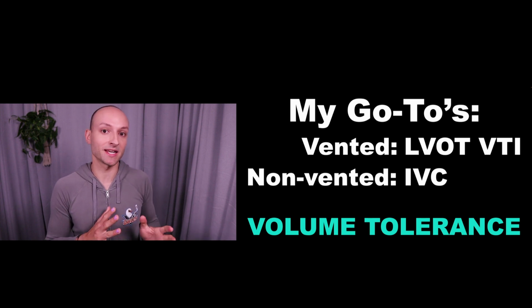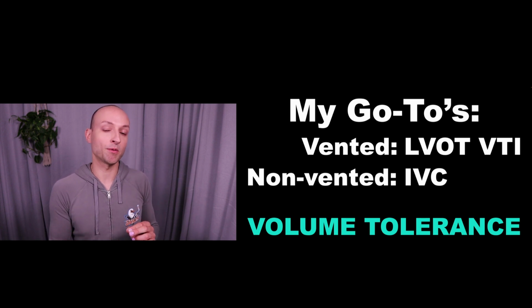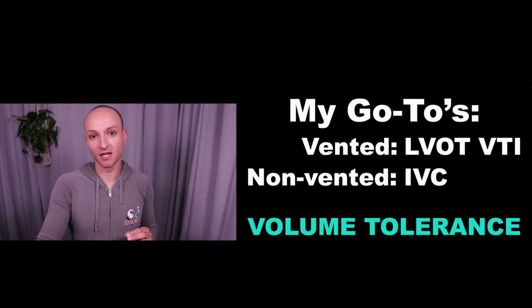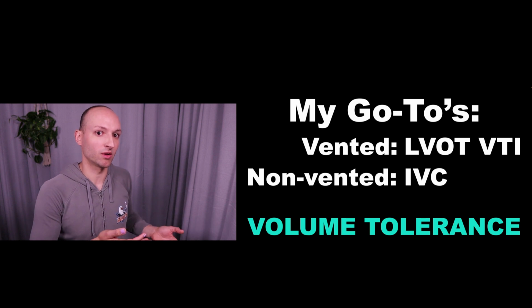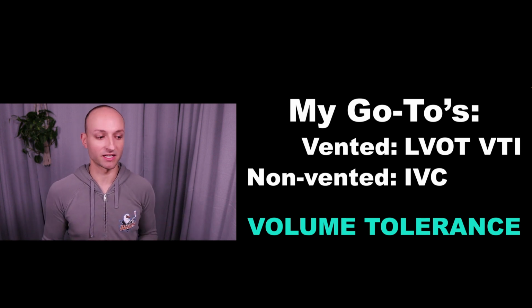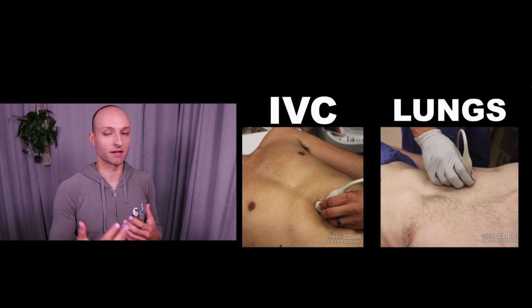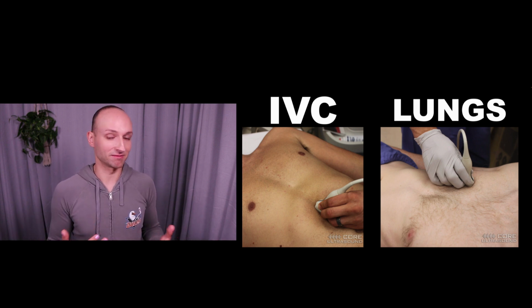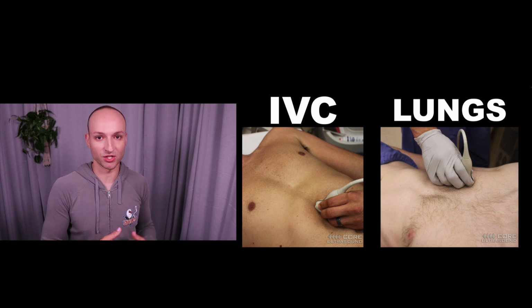It's volume tolerance. Instead of thinking, will fluids increase my patient's cardiac output, volume tolerance asks the question: if I give the patient fluids, will I harm them? Which I think is a pretty good silver medal way of figuring out the volume status of your patient. The way I look for volume tolerance is if I have a patient that's gotten a bunch of fluids, which by the way, I'm not even asking this question unless I'm 4 to 6 liters in on most patients. If they have heart failure or are on dialysis, I'm going to ask this question a bit earlier.